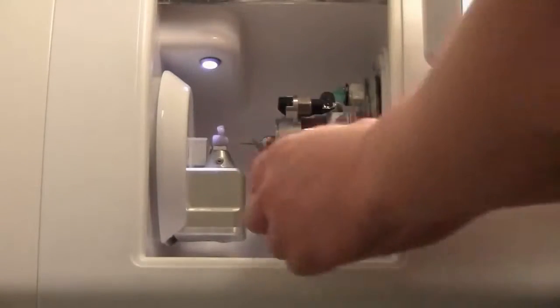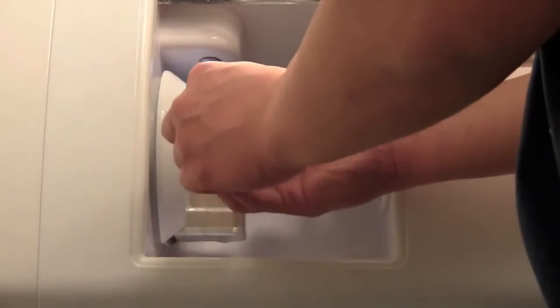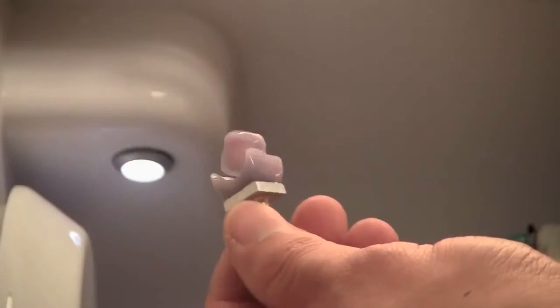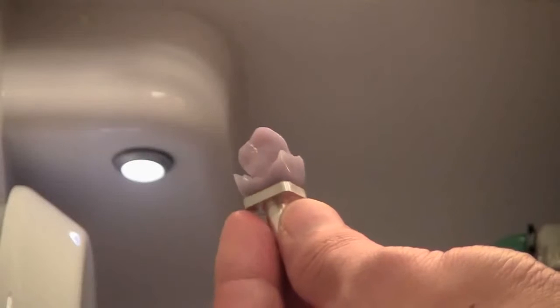So each of these restorations take about 15 minutes to mill, and during that time you could actually either work on another patient, or a great thing is to work on any direct restorations that need to be performed on the patient. And with the lithium silicate material, you can see it comes out a little bit in a purplish color. It's just a good reminder that you do need to put these in the porcelain furnace for about a 20-minute cycle, and it takes it up to about 810 degrees centigrade for 10 minutes.